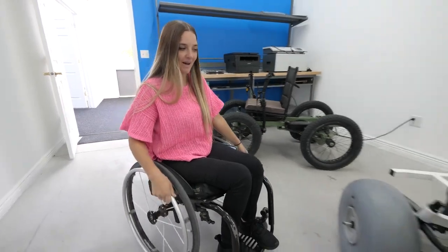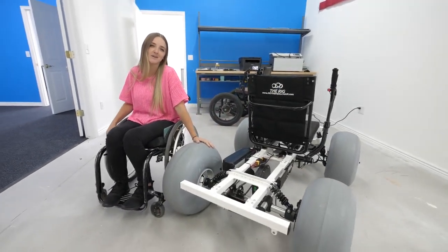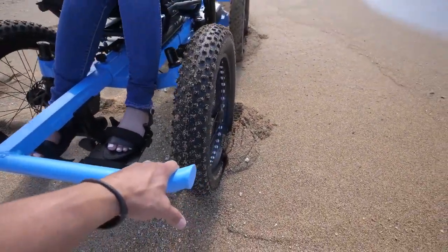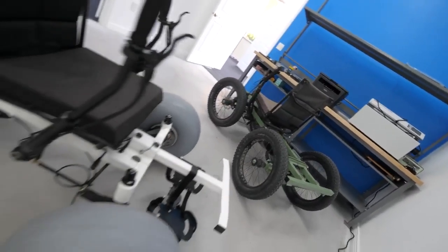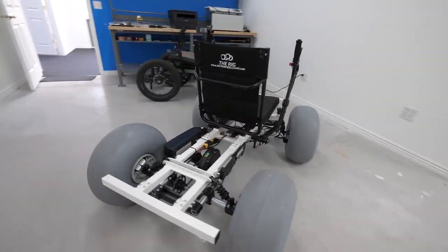And since you've made it this far in the video, I think it's only fair that you see a couple of the projects, sneak peeks, that we're working on right now. Something I'm excited about are these new sand tires we have for the rig. We're calling it the Rover package. If you remember from some of our previous videos, the rig has a difficult time in sand. It gets kind of stuck. The Rover package with its wider tires should make it easier to drive on sand.